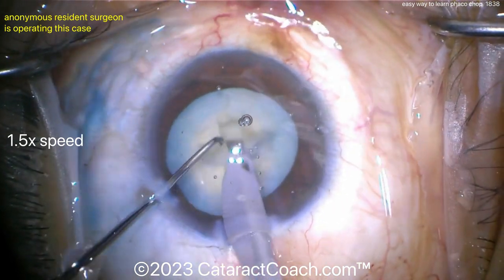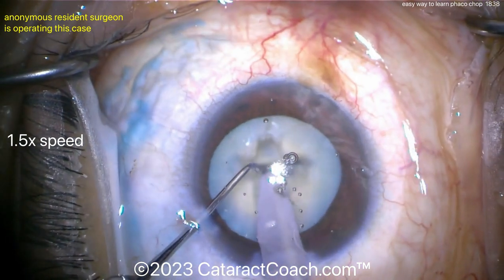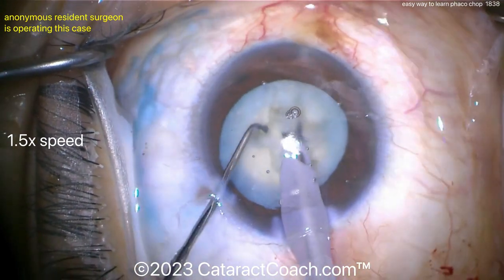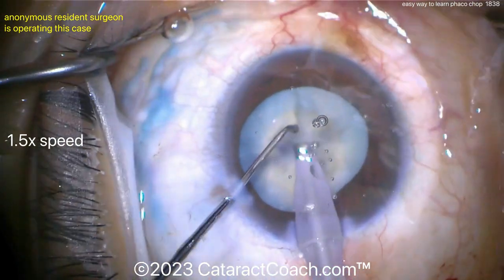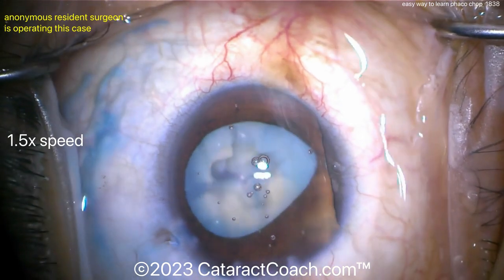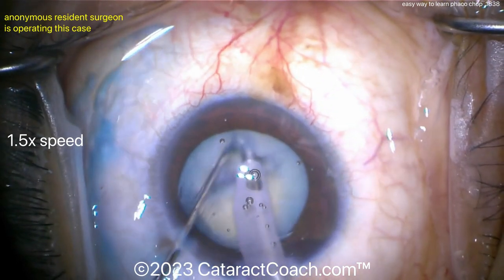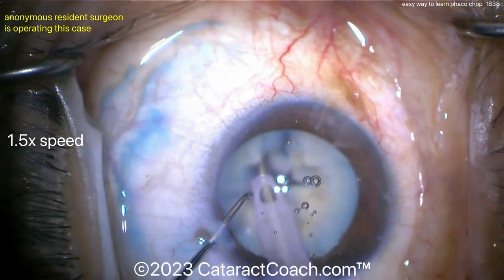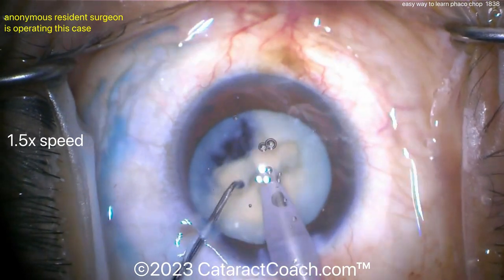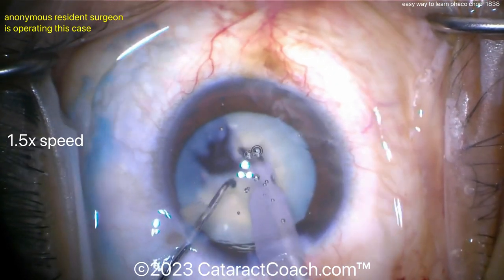Eventually you'll work your way up from doing divide and conquer and sub-chopping each quadrant to doing stop and chop — meaning one groove to create two hemi-nuclear halves and then chop each half. From stop and chop you'll make the transition to full chop: no grooving needed. The resident surgeon is going back inside the eye getting this quadrant split. You should have four distinct quadrants, and then the chop will be easy and the rest of the case very quick. We took about six minutes just to create the quadrants — that's the beauty of chop; you could have those quadrants in seconds. A quadrant is chopped into two eighths and taken down — you can see how much more efficient straight chop would be.